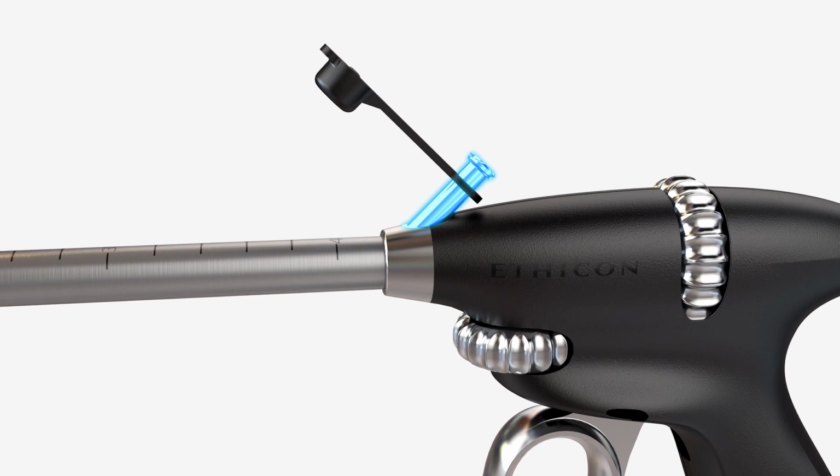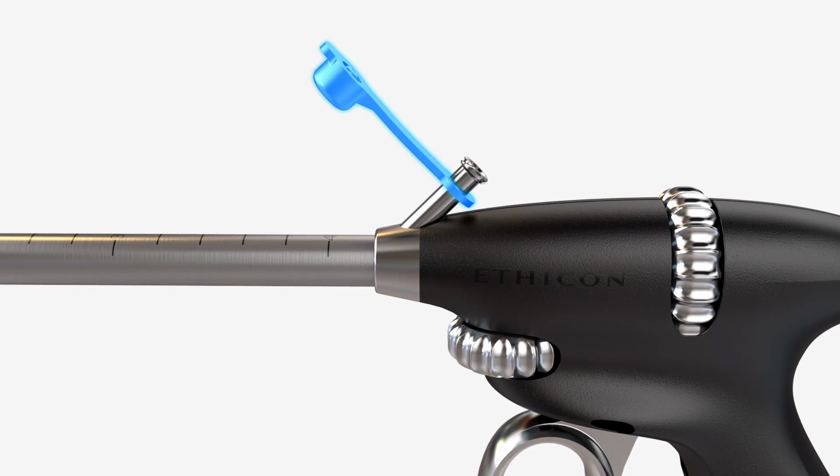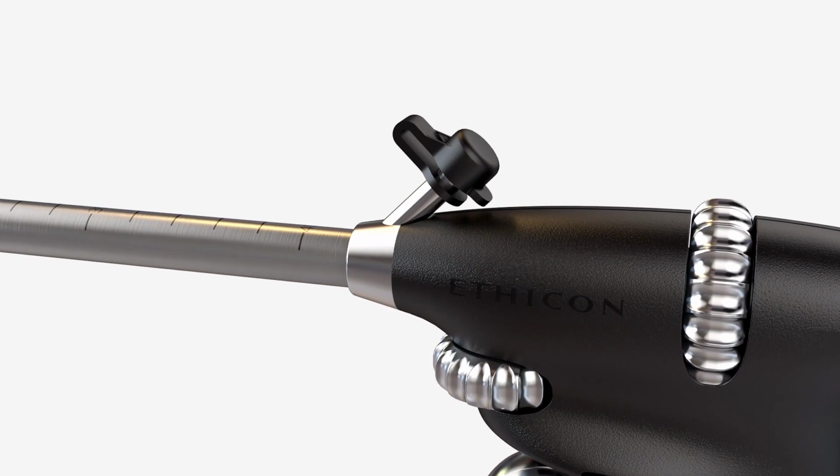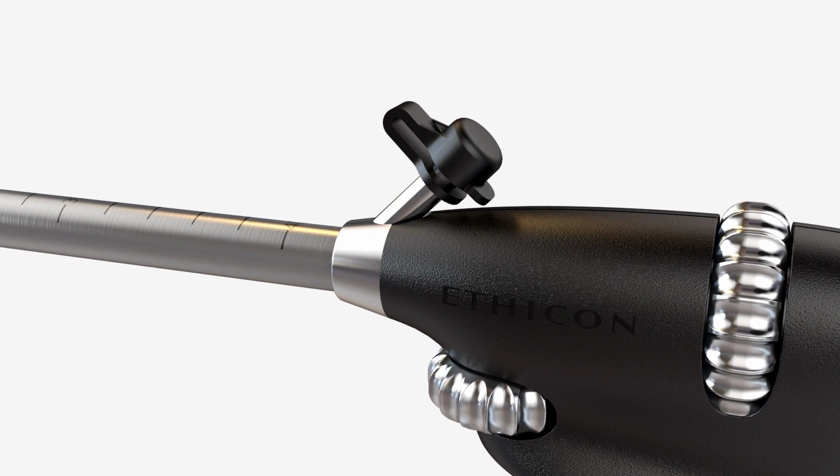Prior to use, close the flush port of the device with the luer cap to prevent air leakage and loss of insufflation during the procedure. The instrument is now ready for use.